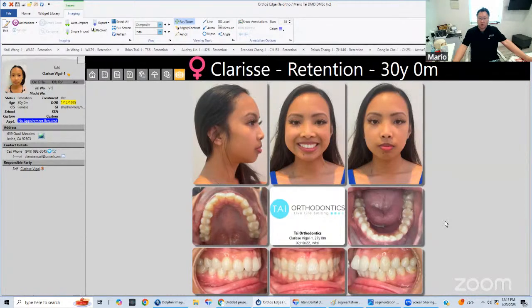she has great oral hygiene. Okay, she's a wonderful individual. She's clean. She has good records. And so I said, okay, let's give it a try and see how things go. So she came in and, as I mentioned, she's class 1. Okay, so she's class 1 molars of malocclusion with moderate to severe crowding, especially the lower.